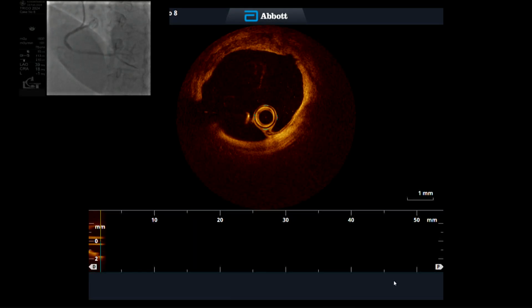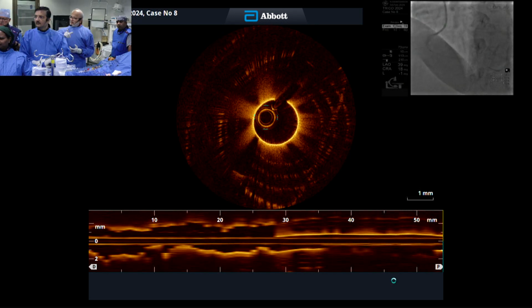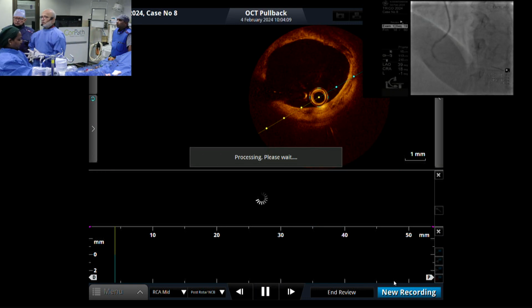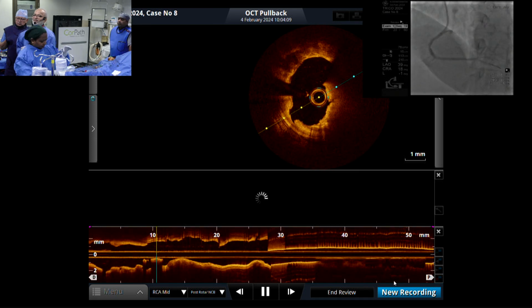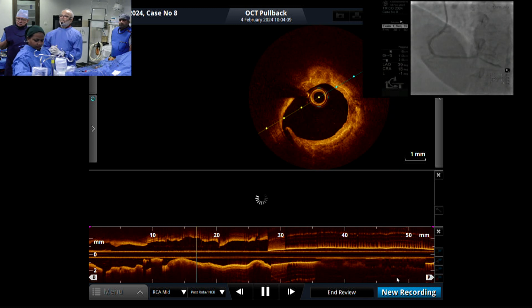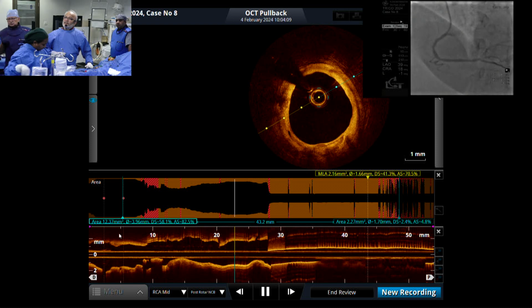This will come out very fast. I think we have done some good cracks on the nodule. For sure, the way the catheter moved.